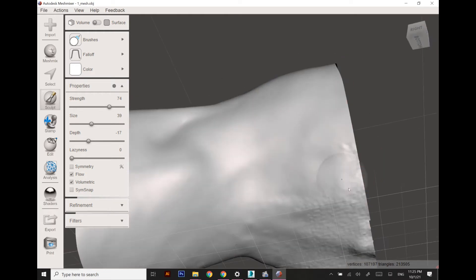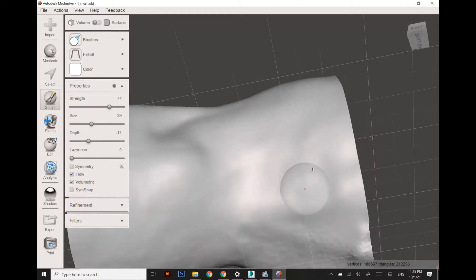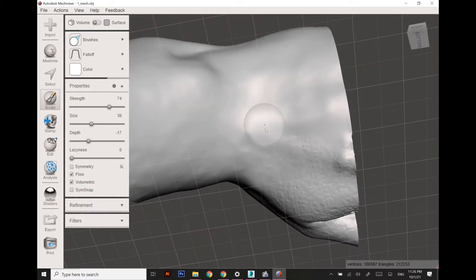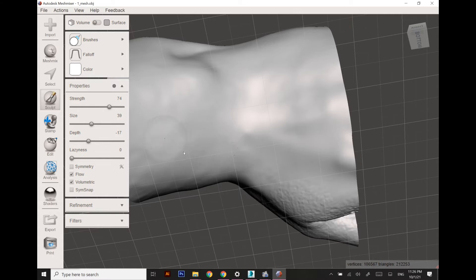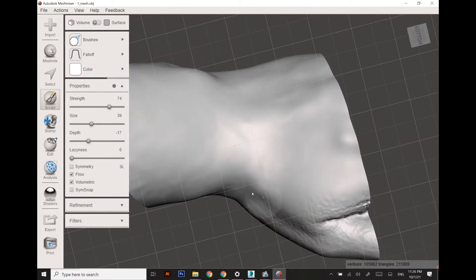Once the areas are quite good enough, as you can see the whole surface is very smooth right now.